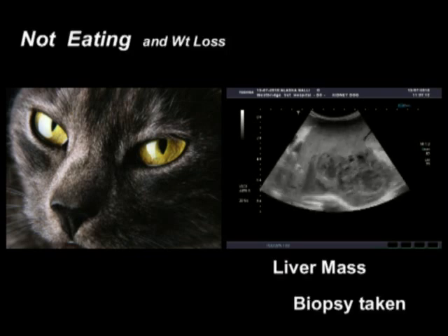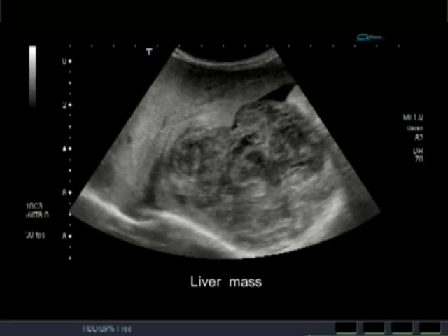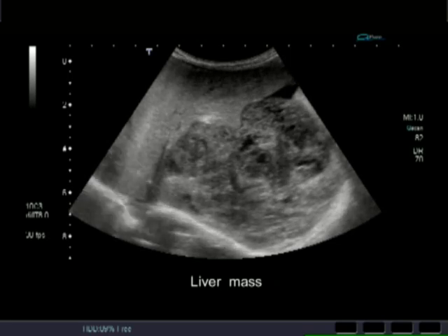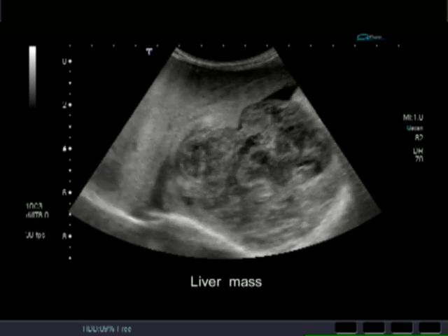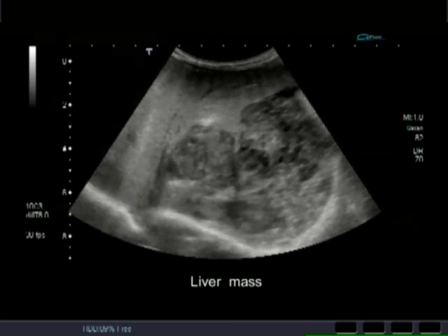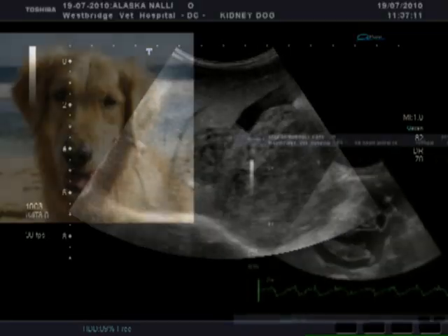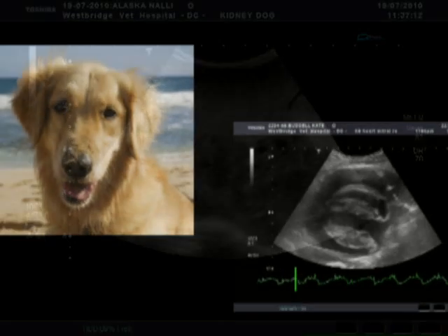This cat was not eating well and losing weight. The ultrasound showed a mass on the liver, and biopsies confirmed its presence and gave us options on how to treat.